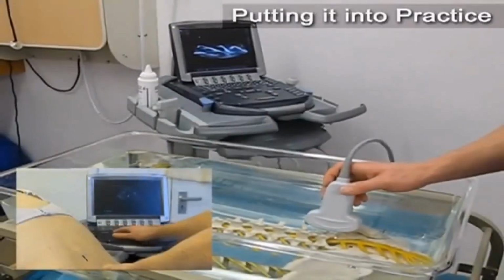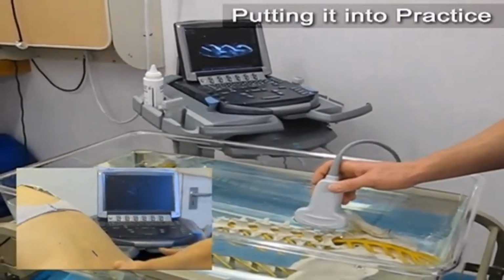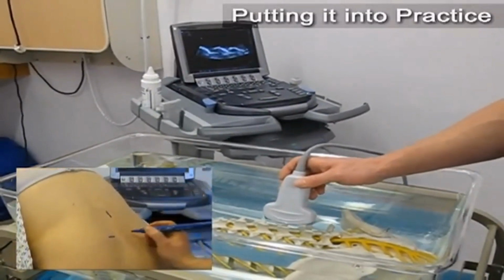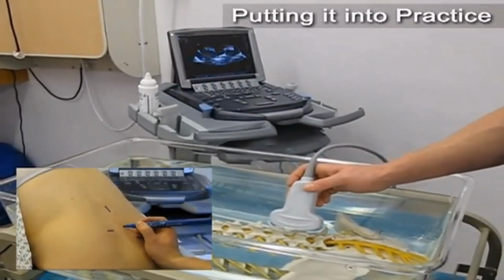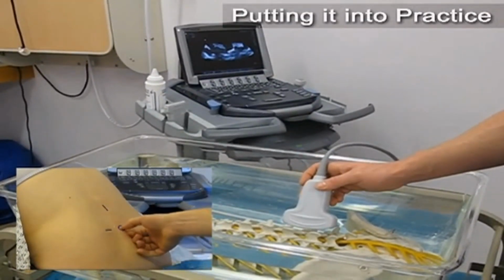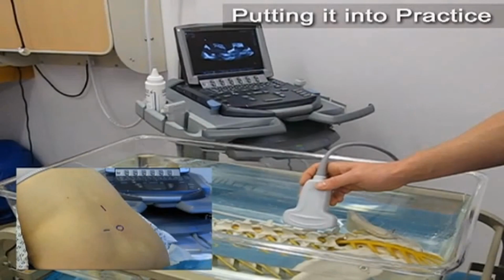The technique can be practiced using a spinal model immersed in a water bath. This is useful for familiarizing yourself with the ultrasound appearances of the lumbar anatomy. To effectively use the technique on the more challenging patients, it must be practiced on individuals where the anatomy can be easily demonstrated.